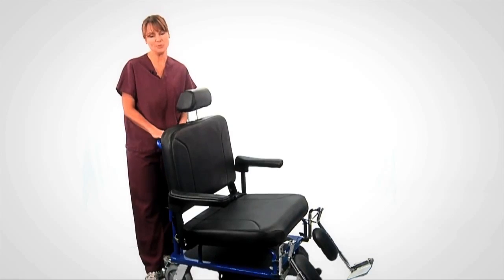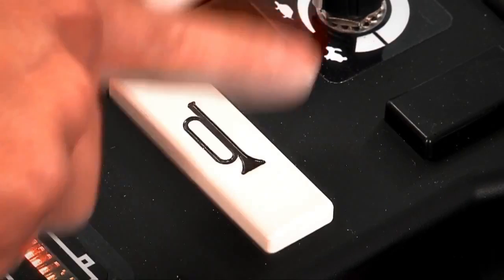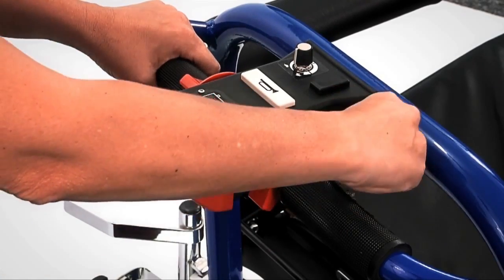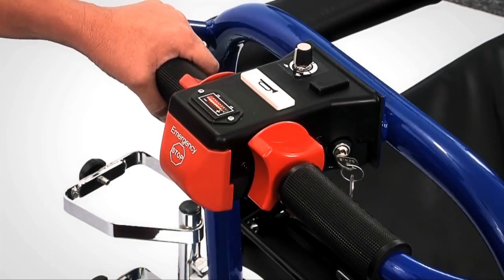The Breeze can travel between one and a half and three miles per hour. Adjust anywhere between these speeds. Press the horn to warn others that you are coming. The emergency stop button brings the Breeze to a complete stop and the battery indicator will flash. To reset, turn the key switch off and then on.